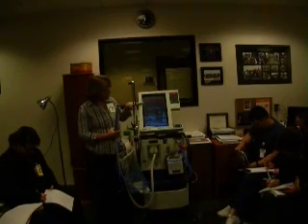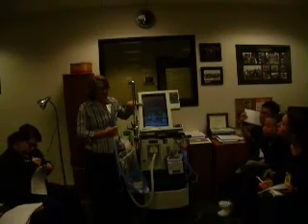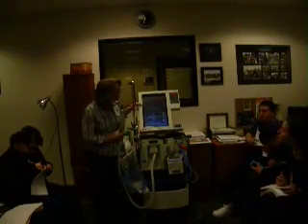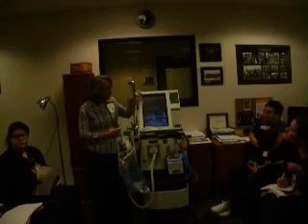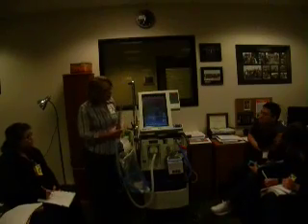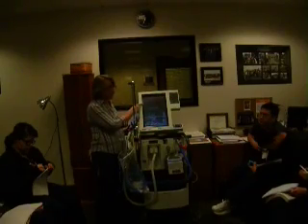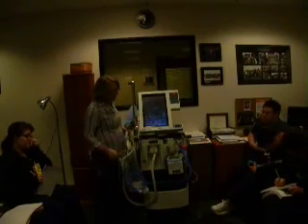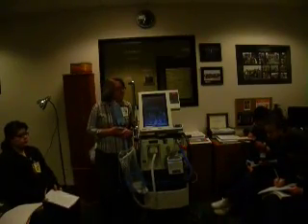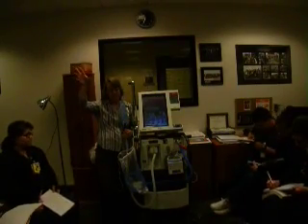So that's all that. Here's your waveforms. Graphics. Oh, plot setup. That's where you can go in and change what you can see on there. And then down at the bottom we have alarms. This is our third. No, 4th. Graphics was our 3rd. 4th is alarms. So there's where our alarm settings can be set. Set parameters, patient parameters, graphics, and alarms.